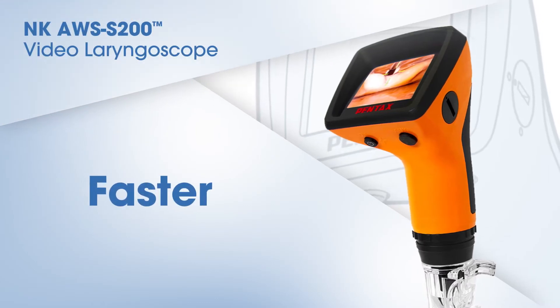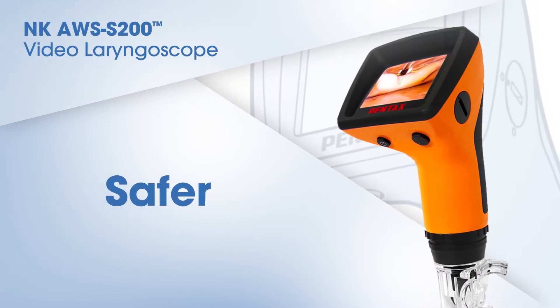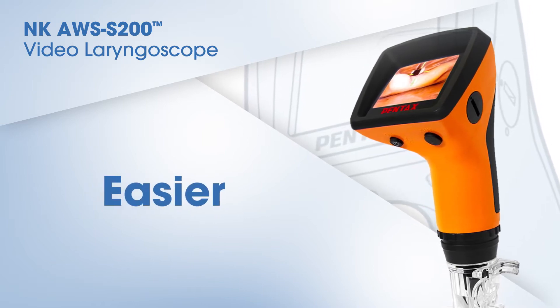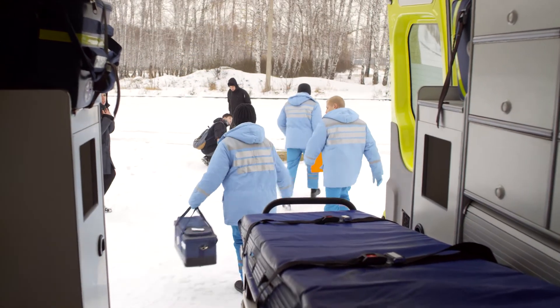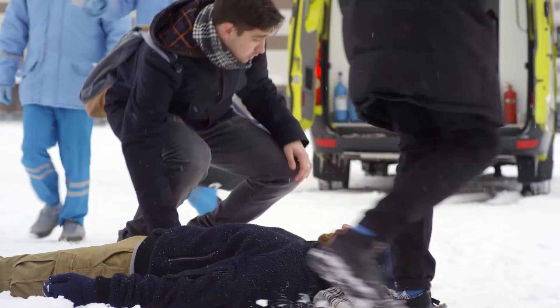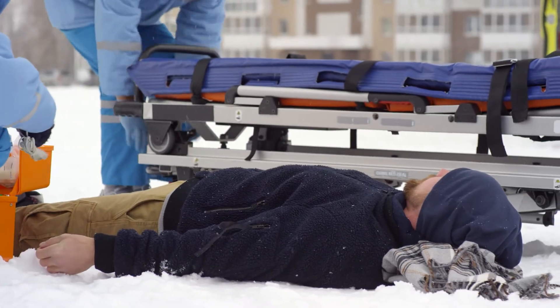The NK-AWS S200 handheld video laryngoscope allows for safe and secure tracheal intubation without extending the patient's neck and can be performed in the neutral position. As a result, tracheal intubation can be safely performed for patients with trauma and suspected spinal and spinal cord injuries without removing the c-spine collar.